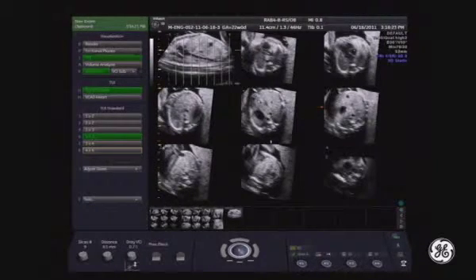You can see it here very clearly in the asterisk section. And the position of the stomach in relation to the descending aorta and inferior vena cava is very, very clear. You can go a bit higher and you start seeing the nice four-chamber view, and the position of the heart, the axis of the heart, is very clear.